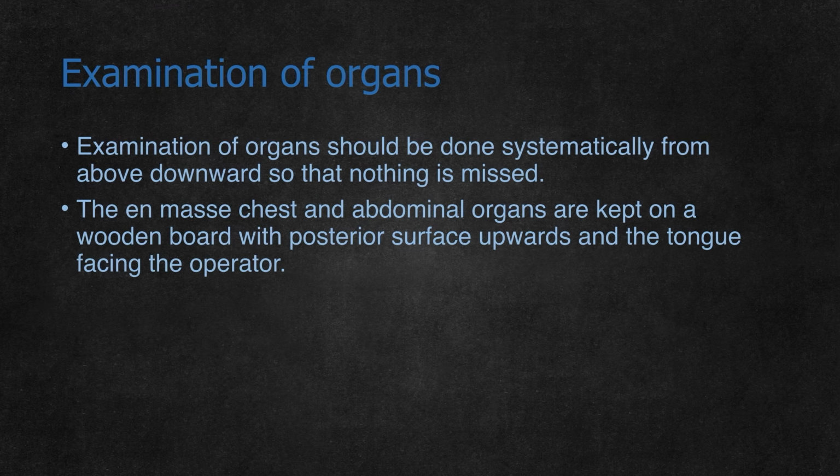Then cohesion. It is the strength within the tissue that holds it together. Organs are held together by their properties, but in some pathological conditions this may be lost. It is judged by resistance of the cut surface to tearing, pressure, or pulling. Using toothed forceps, if the organ is pinched, you see how much pressure is required. If there is reduced cohesion, the organ is friable, while when it is increased, the tissue seems tough or leathery in appearance. That can be detected by using forceps also.